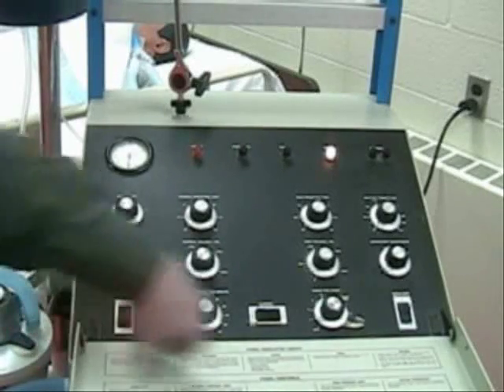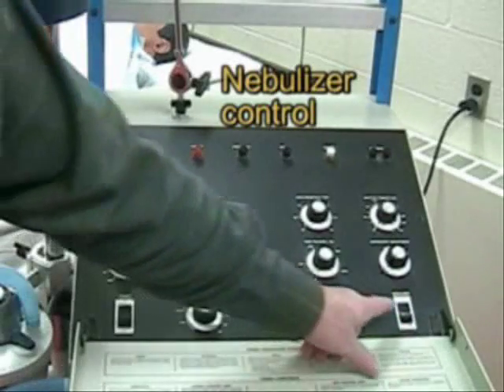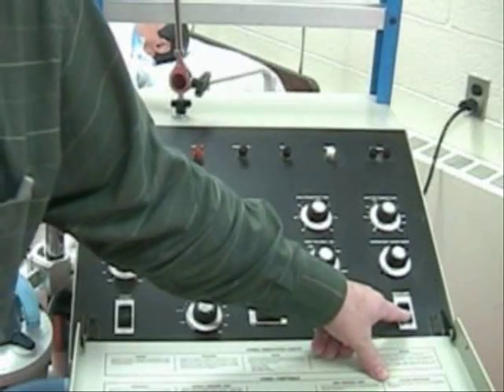Power switch on. Nebulizer switch on — so we can give inline nebulized medications on inspiration only.